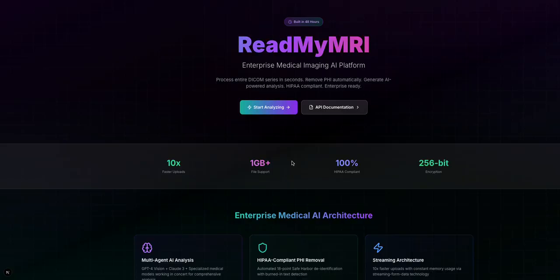It is a zip native DICOM uploading platform where there's a pre-processing script that removes all PHI from the DICOM slices before they are converted into a lossless image format to then be put into a single data frame of choice, where it can be enabled by DAFT distributed querying, which would enable quite extraordinary machine learning pipelines.